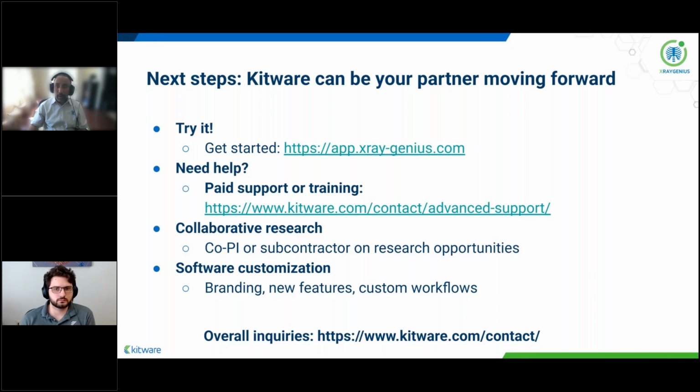Third, you might be working on a research grant proposal or a research project where you want to use X-Ray Genius, and Kitware participates on collaborative research projects funded by the government.